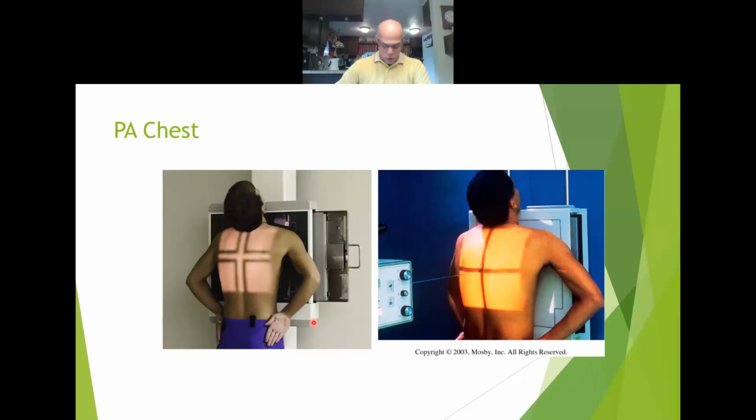Your respiration, on page 108, is full inspiration. This exposure is made after the second full inspiration to ensure the maximum expansion of the lungs. Again, this is something you can be talking about as you're positioning this patient.